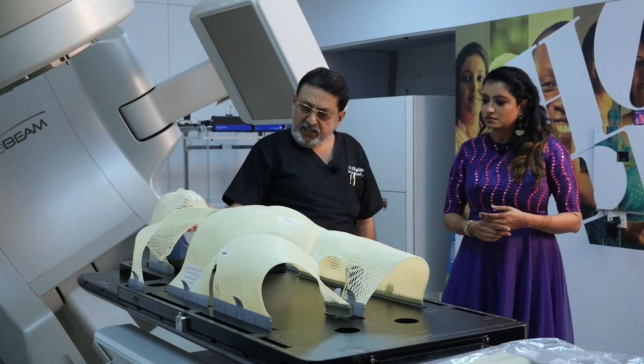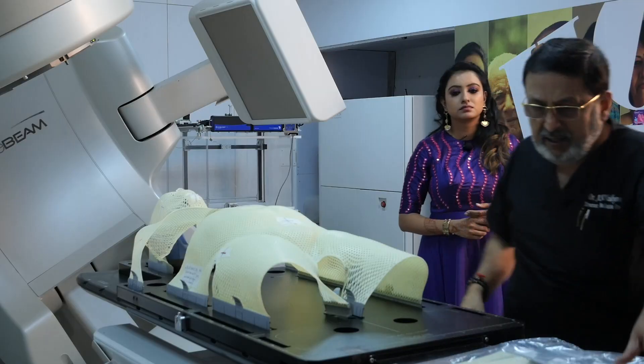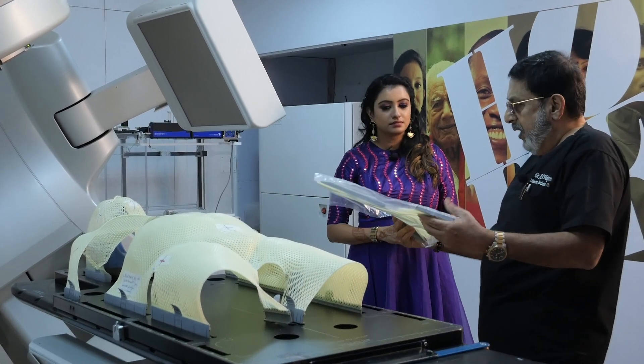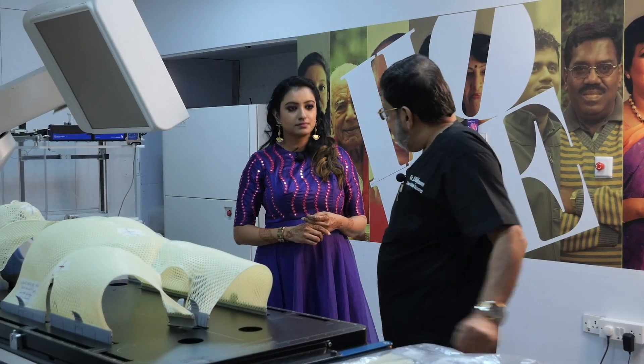This thermoplast for the head and neck is separate, and for the pelvis is separate. Initially it looks like this. What we do is we put it in a hot water bath and it becomes flexible and elastic.